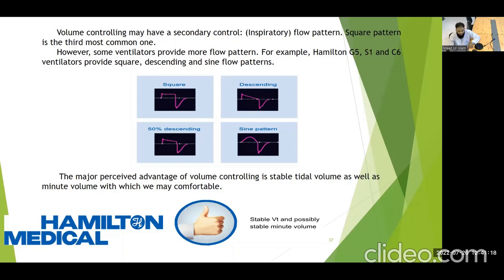So we can gather the complete patient condition through this flow controlling, through this graphical representation.